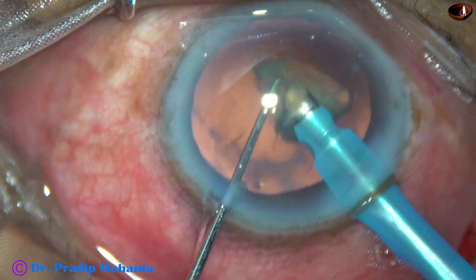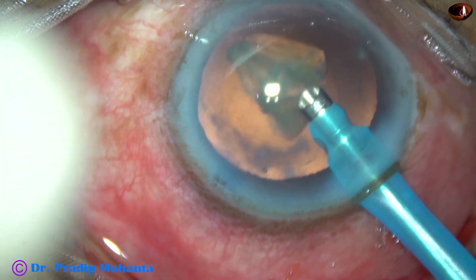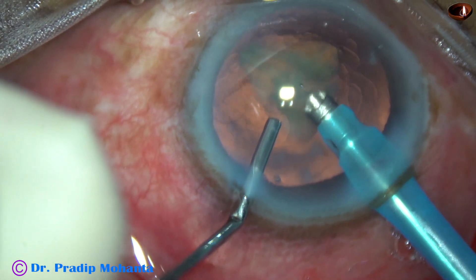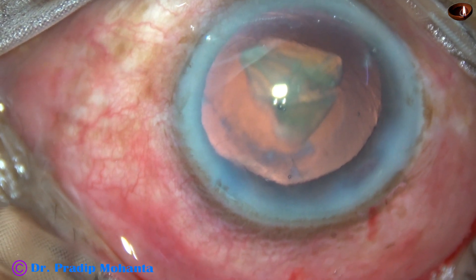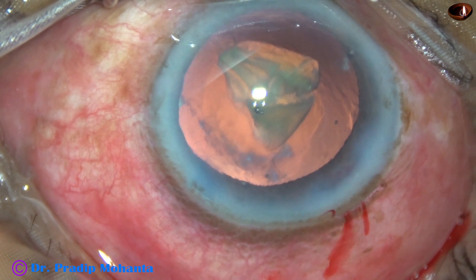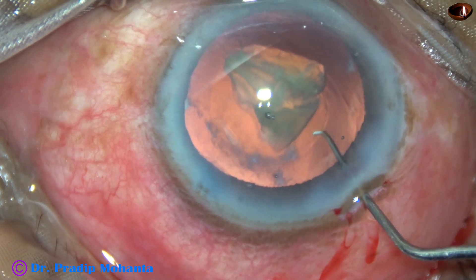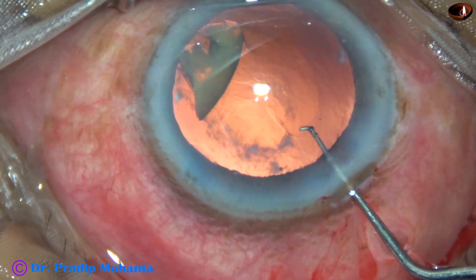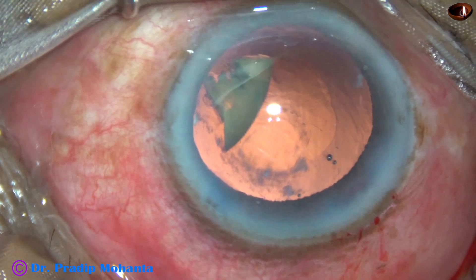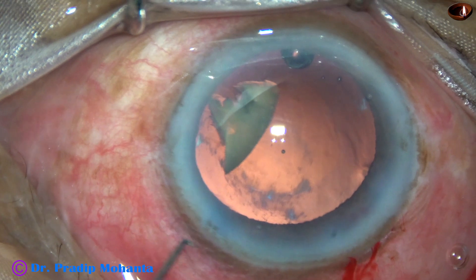And now is the most important part. This small last piece — if I try to emulsify it directly, there is a high chance that I may catch the posterior capsule, even with low vacuum. So I inject visco and come out. The idea of injecting visco is I do not want to allow this piece to come forward and hit the corneal endothelium. I inject visco and come out, then push this piece towards 6 o'clock. You can see the back very nicely.